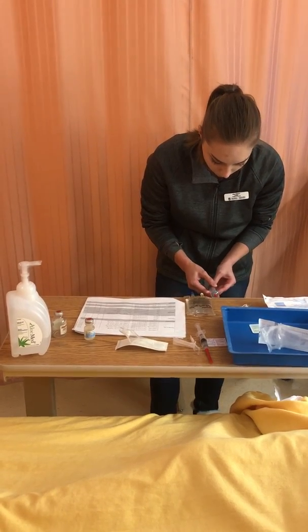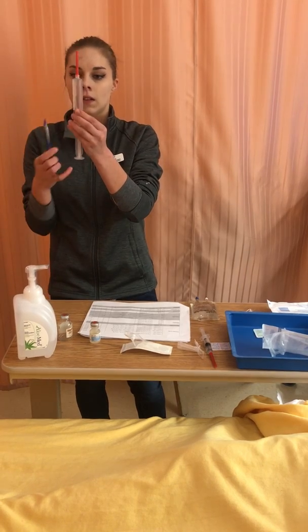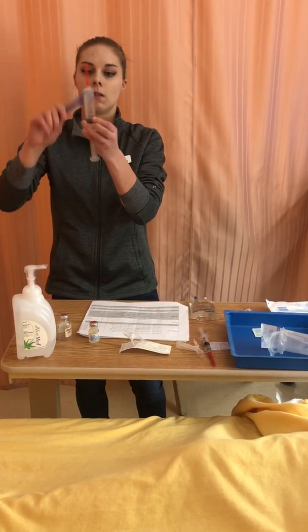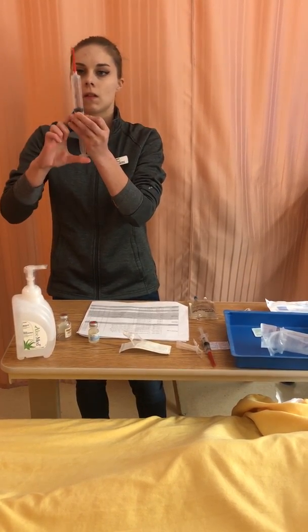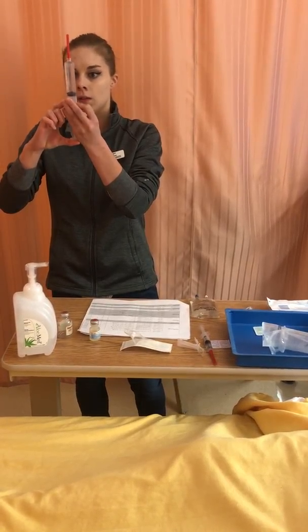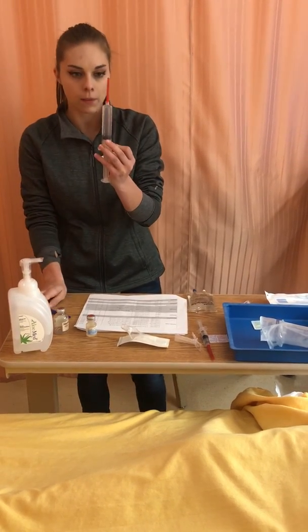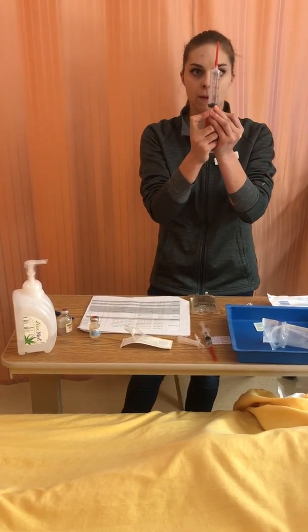So the medication I'm giving you today is an antibiotic. It's for your urinary tract infection. The side effects you can experience are nausea, vomiting, and diarrhea. Your call bell will be right here. If you experience any of this, please let me know, and I'll also be coming back. I'm going to pull back and make room for my medication.